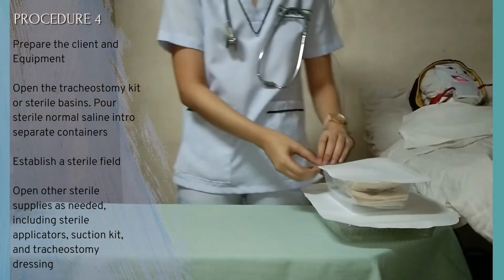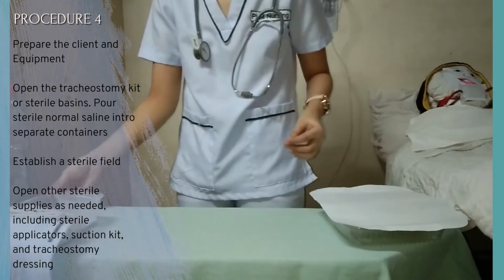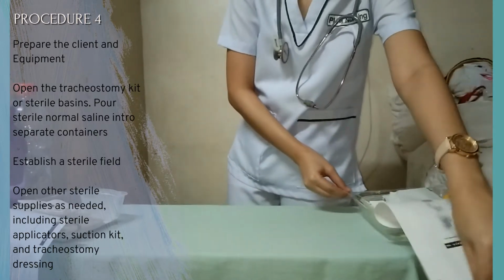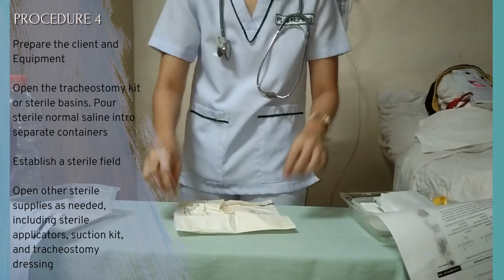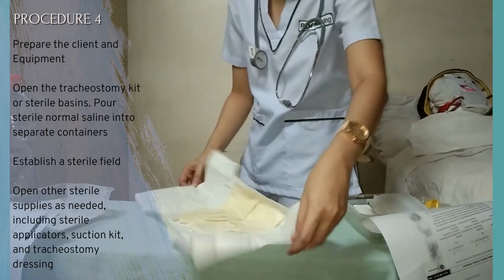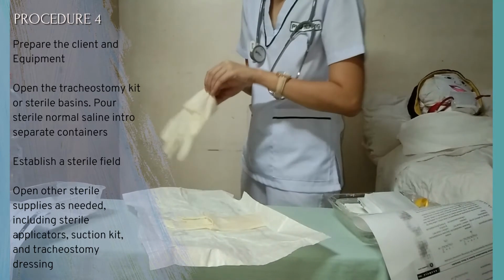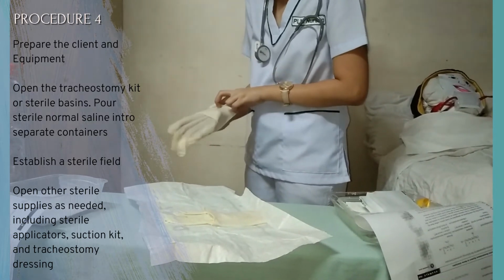Open other sterile supplies as needed including sterile applicators, suction kit, and tracheostomy dressing. This prepares the catheter, maintains asepsis, and reduces transmission of microorganisms. In this case, I have put on my glove first so that I can organize the tracheostomy kit. Gloving reduces transmission of microorganisms, prevents risk of infection, and maintains sterility of the suction catheter.